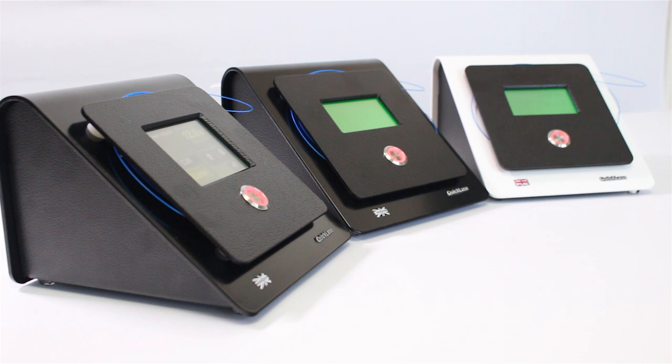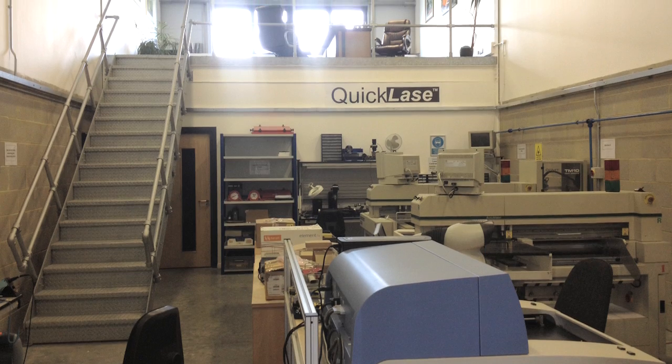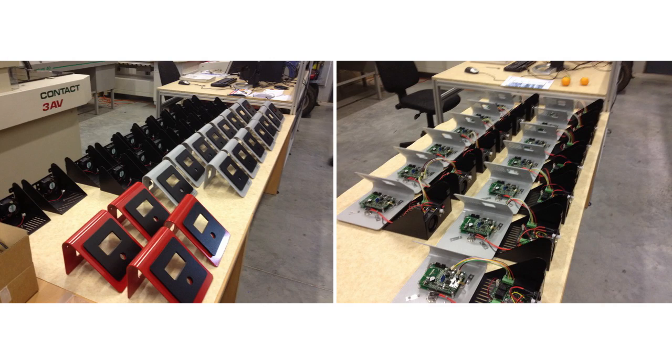QuickLase have been manufacturing soft tissue lasers in the UK since 1992, selling worldwide and providing immediate backup and support.